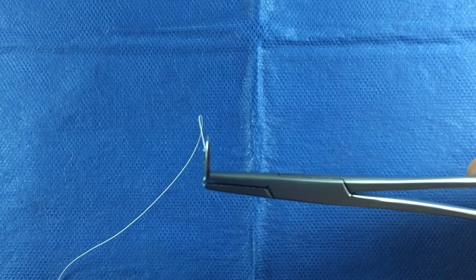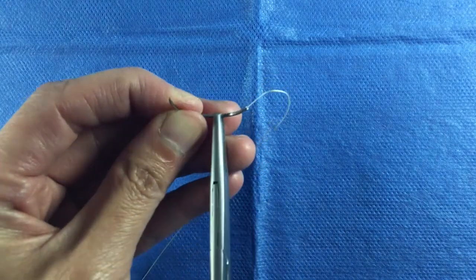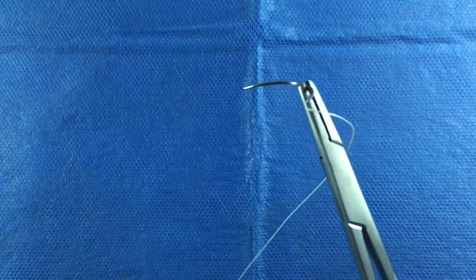Be sure to grasp the needle at the very tip of the needle driver. Every millimeter off will cost you precious control of the needle. Finally, tip the needle 30 to 45 degrees up. This configuration will give you the best angle to work with.